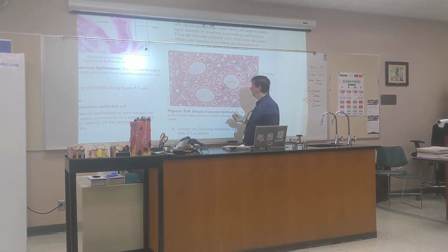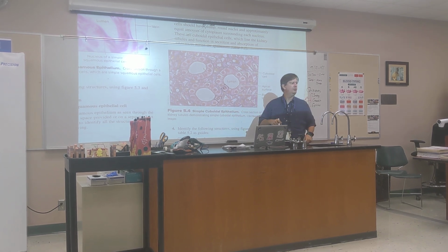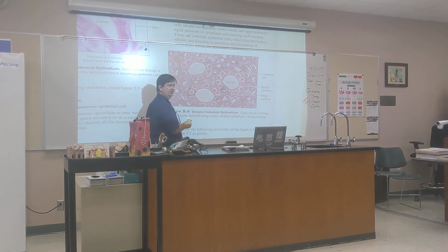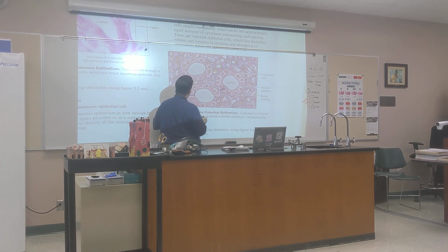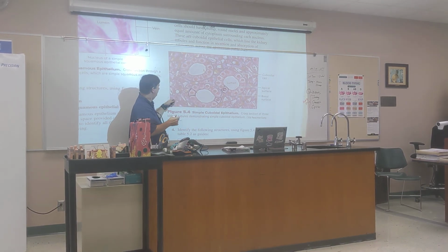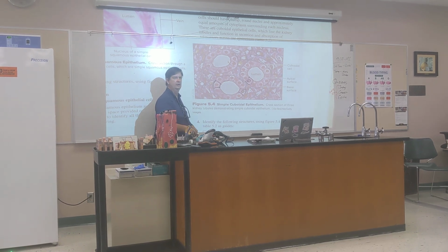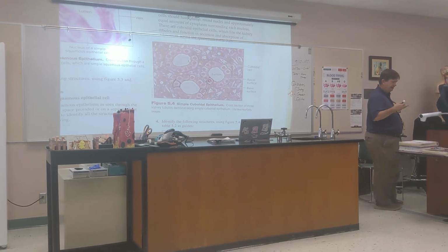So what do we know? If it's kind of the same height and width and the nucleus is round, we're going to call it cuboidal, even if it clearly is a trapezoid shape, because we don't have trapezoidal tissue. Does that make sense? That's still simple cuboidal, even though it's not looking very cube-shaped. This one's even worse, but that's simple cuboidal. And this, again, is still kidney tubule. Good? So a location for simple cuboidal would be kidney tubules.